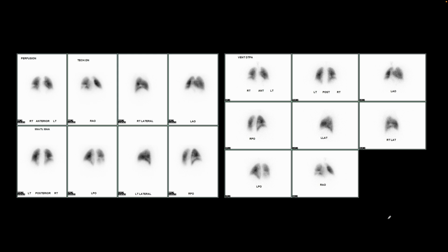During COVID time, a lot of centers decided on doing perfusion only studies, and we didn't want to do ventilation because of the COVID precautions. And also we know from myocardial perfusion imaging that stress only protocols are very popular. When the stress myocardial perfusion images are negative, the resting part is not needed.